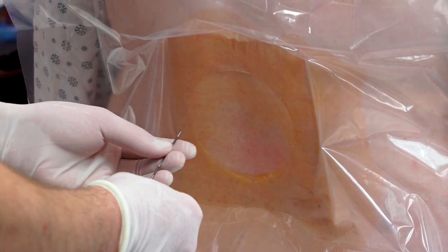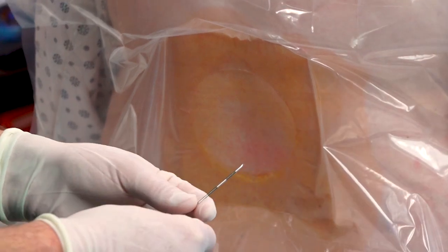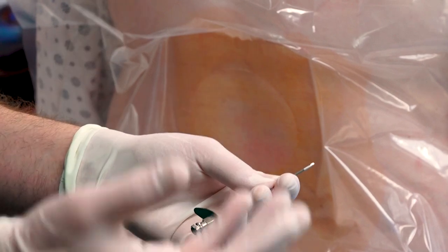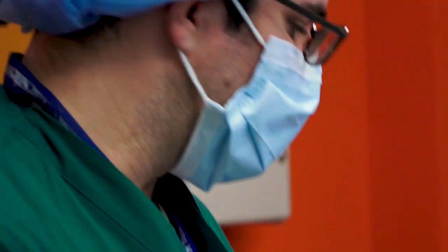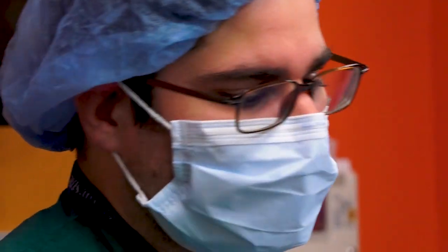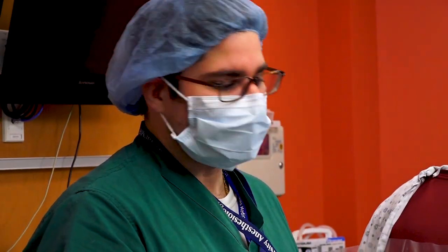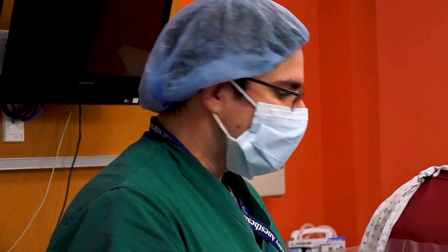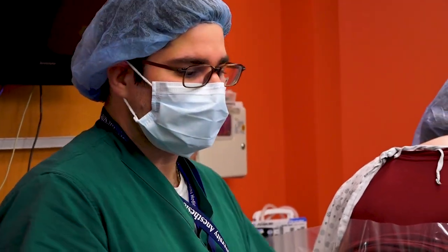It's very important at this point to remember the estimated depth from the ultrasound, because around that depth is when you are going to start feeling engagement to the ligamentum flavum. By no means should the ultrasound supersede clinical judgment — the ultrasound is just meant as guidance and as a safe alternative to obtaining a good interspace.